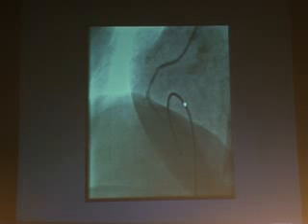How to manage this particular problem? Generally, since you are able to go distally, there is no hemodynamic compromise in this patient, because the moment you go distally, the flow is established in the artery. In this particular case, the patient did complain of some chest pain, though there were no significant ECG changes or hemodynamic compromise in the patient.